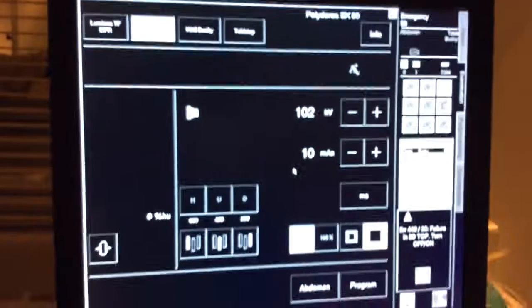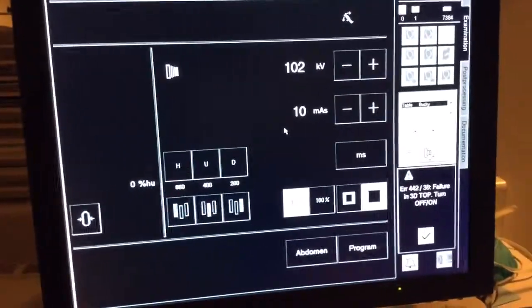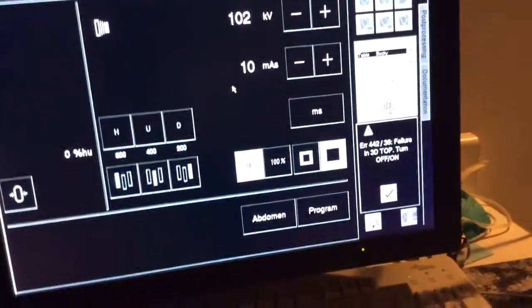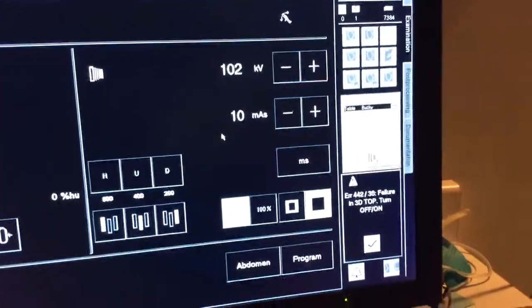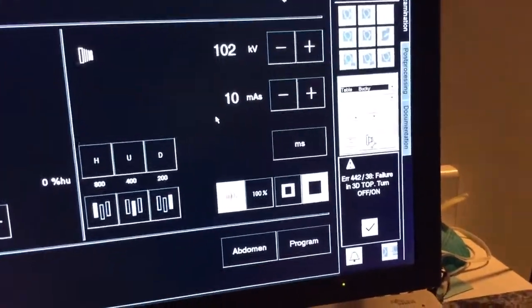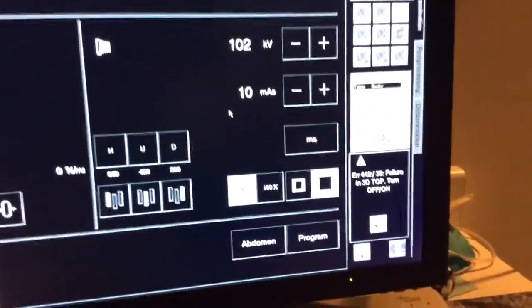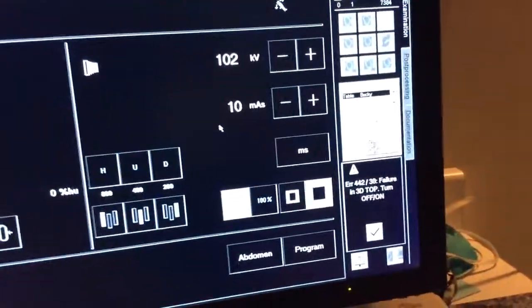I would then tell the patient to take in another deep breath, blow it out, one more deep breath in, blow it out, this time hold it out, and at that point I would make the next exposure. Normally, books recommend to do an LAO, but once again, doing an RAO places the part of interest closer to the image receptor, producing a better diagnostic image.